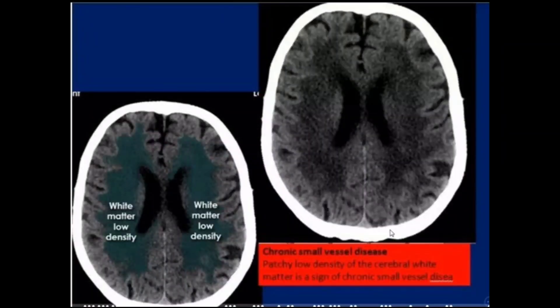In continuation with the previous videos, where I covered the basics of brain CT scans, including the distribution of arterial territories — middle cerebral artery, anterior cerebral artery, posterior cerebral artery, and the vertebrobasilar system — this video now presents additional important information.